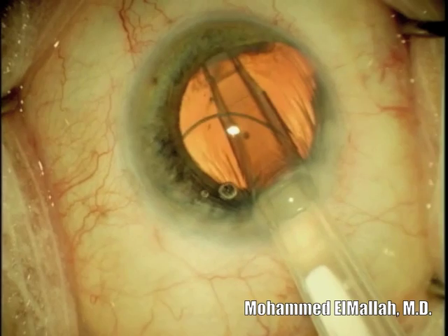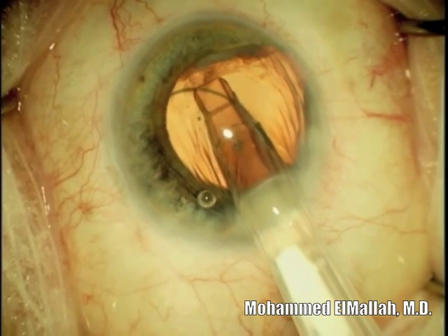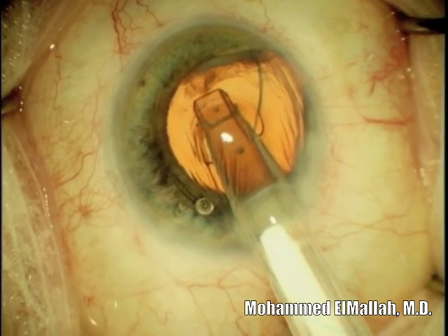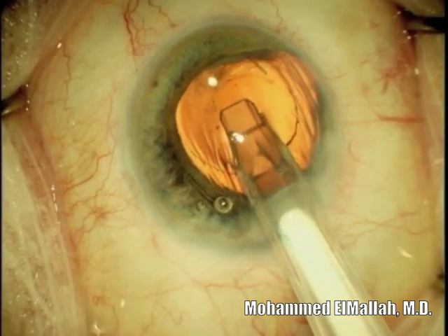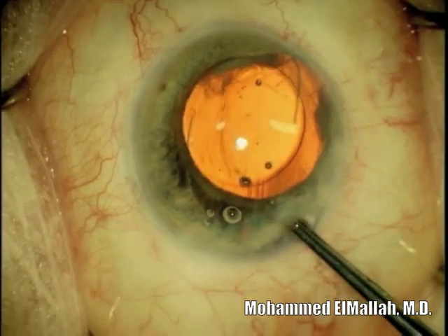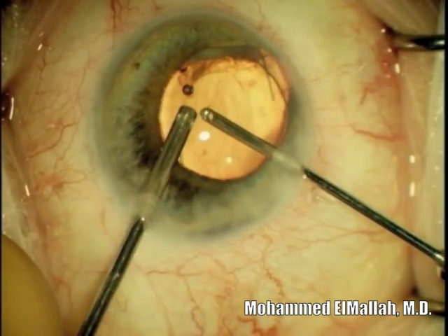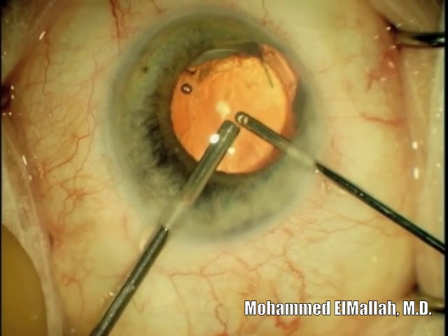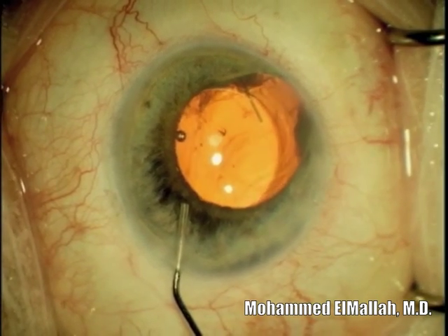Here, a three-piece intraocular lens is injected into the ciliary sulcus. The viscoelastic is removed from the anterior chamber. Miochol is injected to constrict the pupil. The new intraocular lens is well centered.